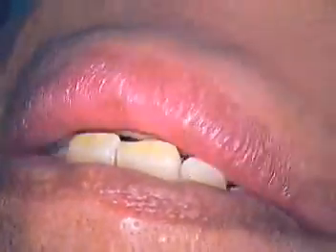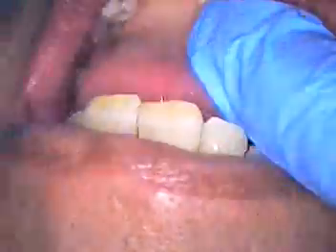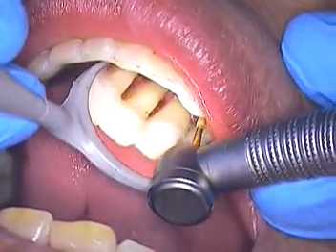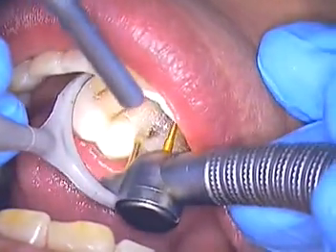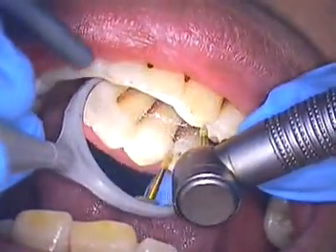We're going to call you the big E around here — you're looking good for excellence. A little sharp spot? Let me get that. A little bulbous — let me adjust it down. So that's the only spot, right? He's just brought to my attention that there's a little bulbous area of composite right over here. So with the dam off, you can actually see more. I'll have a little air on that. We're just going to bevel it — I'm not going to thin it too much, but I'm going to bevel it. Certain teeth stand out a little bit more than others.